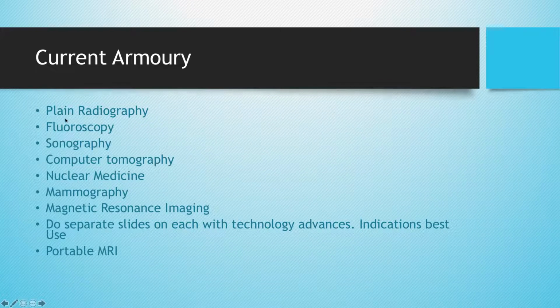So, as I discussed before, we have plain films, and we went through all of these. And something new here, portable MR. They actually have MRI now that they can drive onto the ward. I think it was just recently approved by the Food and Drug Administration. I saw it the year before last at the big radiology meeting in Chicago.